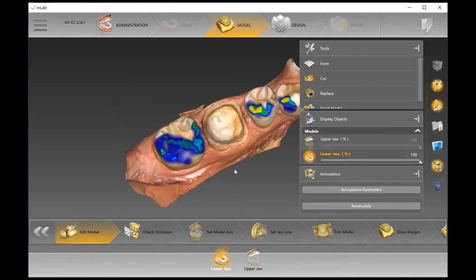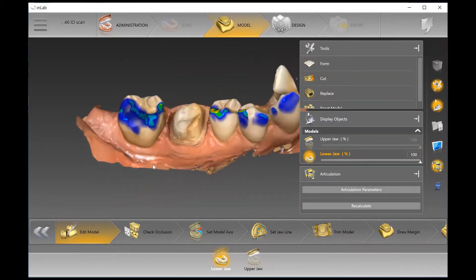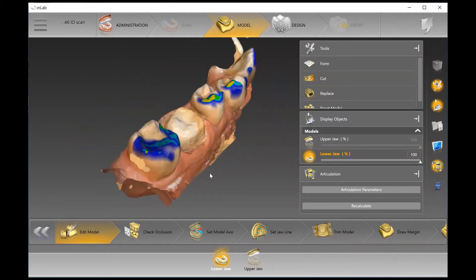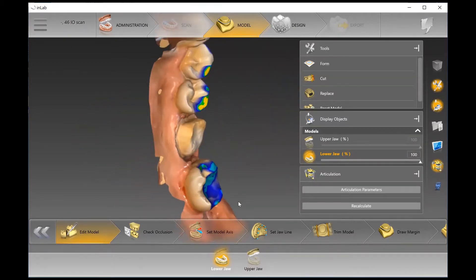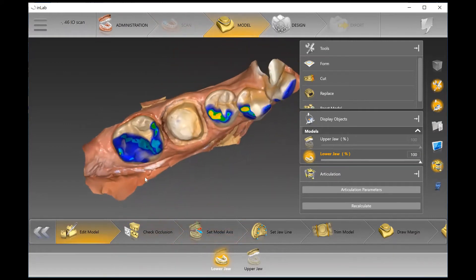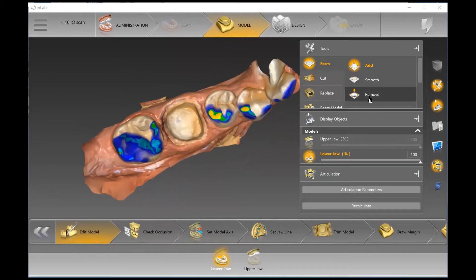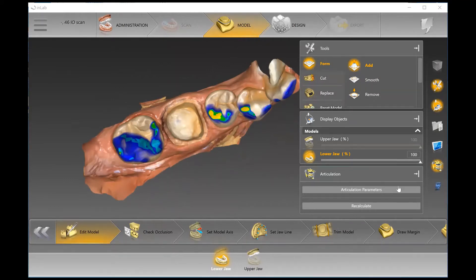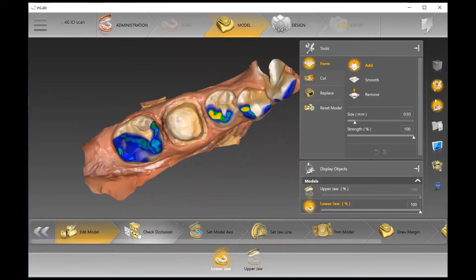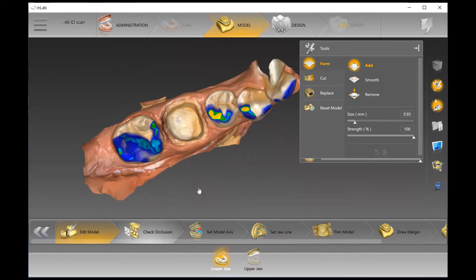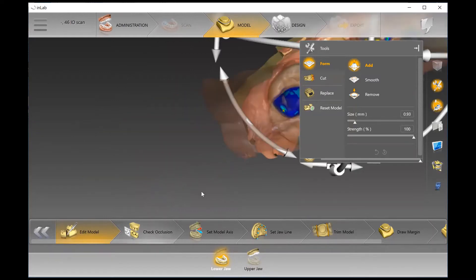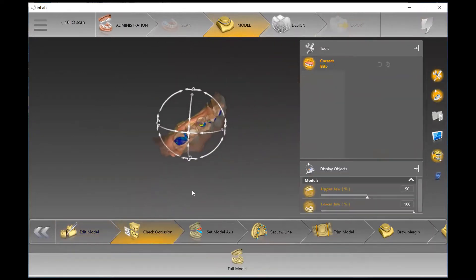The first step here is Edit Model. Exactly as the name suggests, if we need to make any edits to the model or change anything, we can do so here. We have the Form Tool to add, smooth, or remove material from the model; the Cut Tool to cut things out of the model; the Replace Tool to fill in any small holes; and Reset Model to reset the model to its original scan.